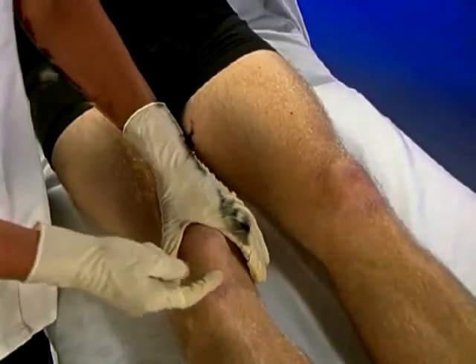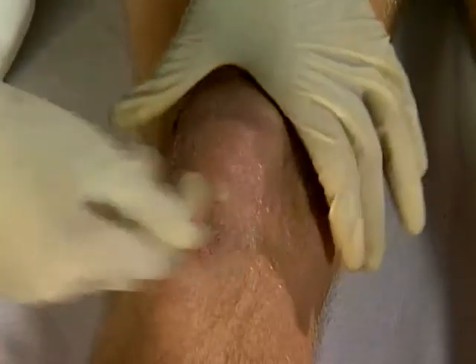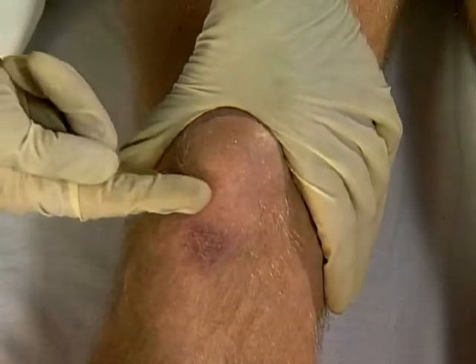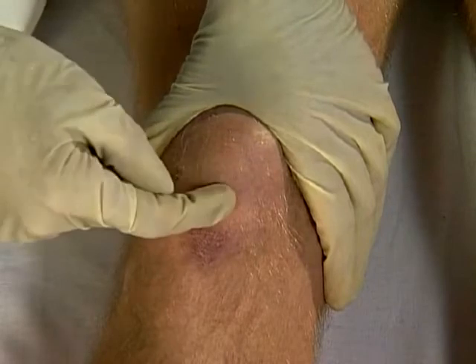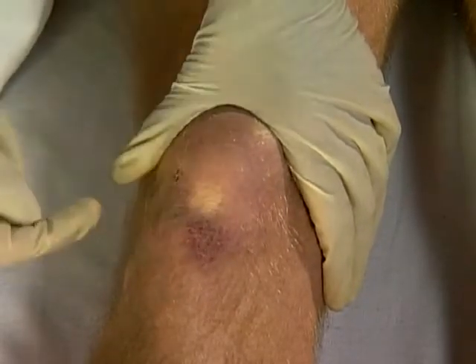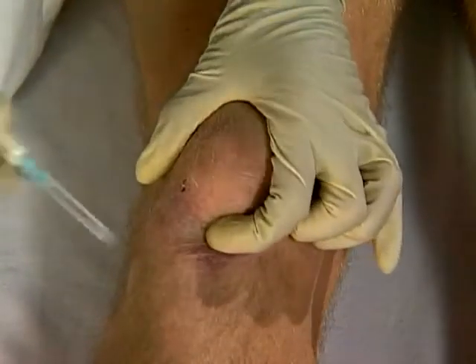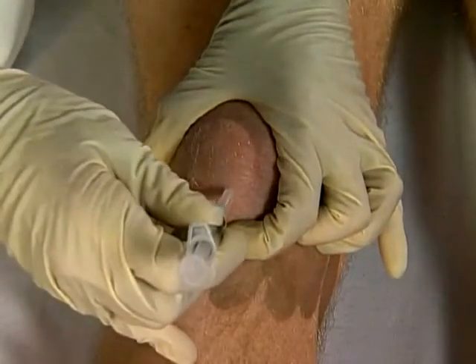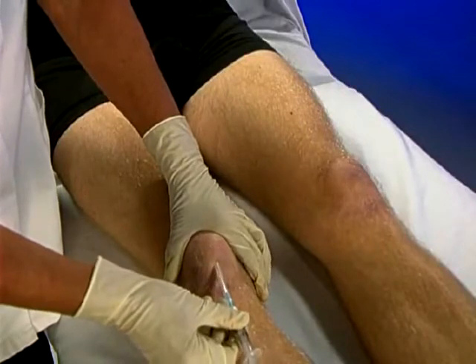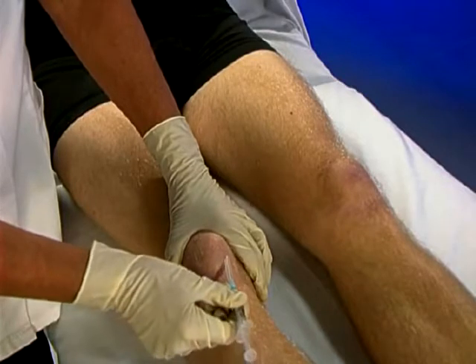The tendon arises from the inferior pole and is about 2 fingers wide. It's usually affected at its origin, which is found by depressing the superior pole downwards to make the inferior pole prominent. Identify the edge of the bone, mark entry point here, clean and firmly stretch skin, and rapidly insert needle perpendicularly. Angle upwards to touch the rim of the patella. Pepper around the rim in both directions.